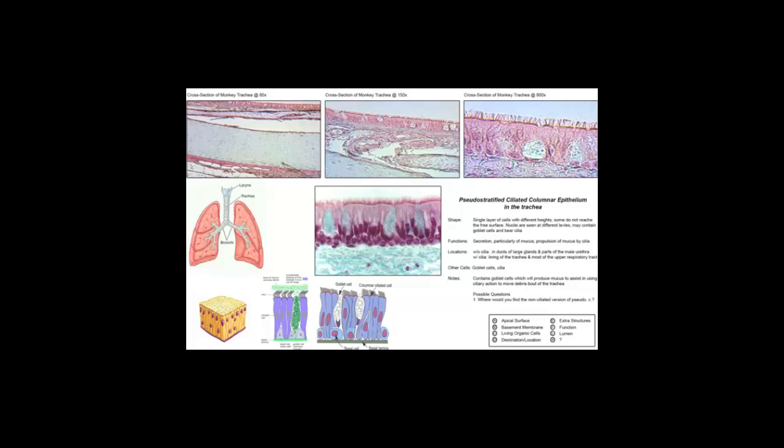Just below the basement membrane, or part of the basement membrane, or lamina propria, we would see where the cells are actually sitting on top of that structure, which is the basal lamina here, seen in this drawing. And then beneath that we have areolar connective tissue, also seen here, and that band of tissue is seen easily here as the double part structure that's going to be identified as the lamina propria. This is mostly identified primarily in the mucous membranes that line our body's moist surfaces or entryways. Down below the area where we have the submucosa, so that's the mucosal lining.